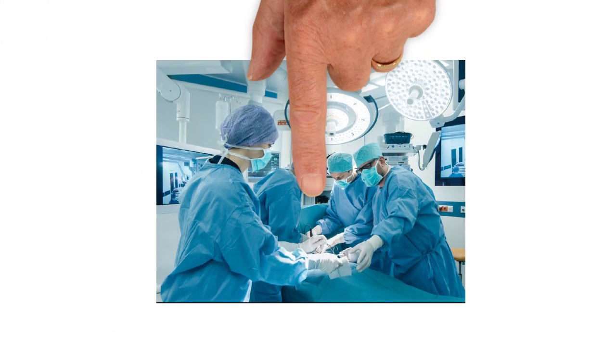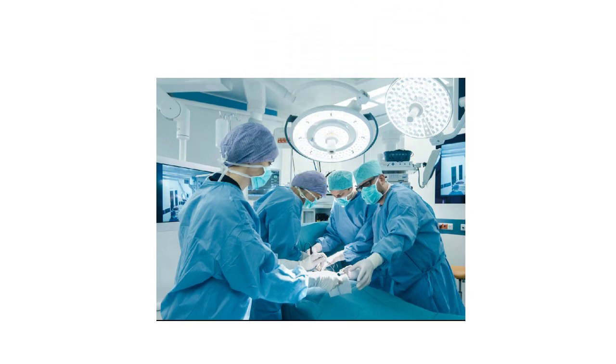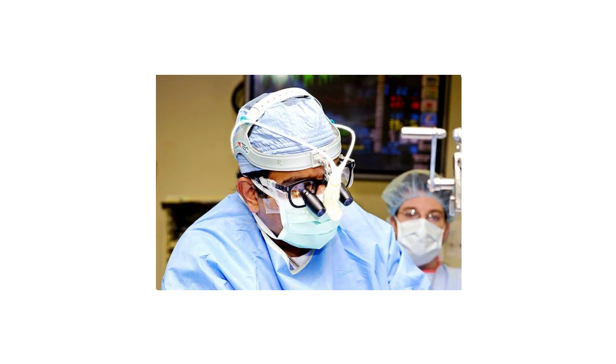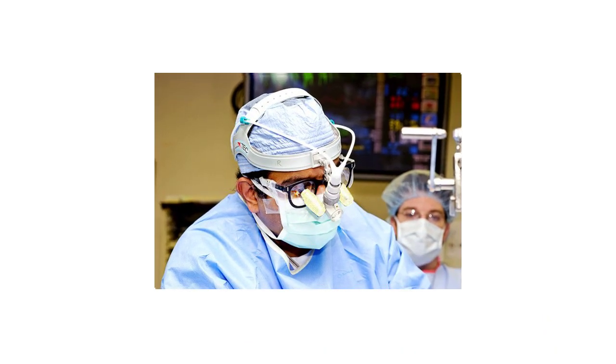Over the years, there have been many improvements in lighting in the operating room. Today, surgeons take advantage of sophisticated overhead lighting. They employ high-tech headlamps, and they even have special glasses called loops to enhance the surgeon's vision.